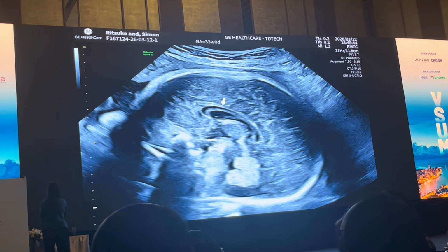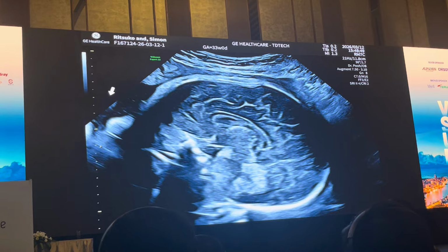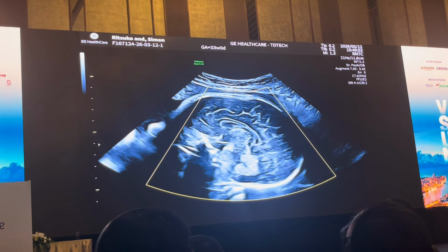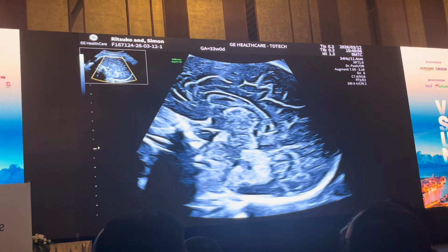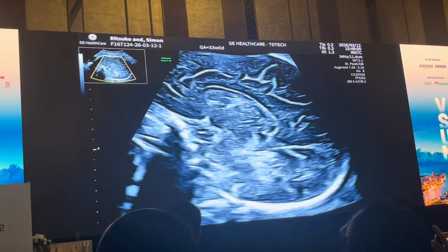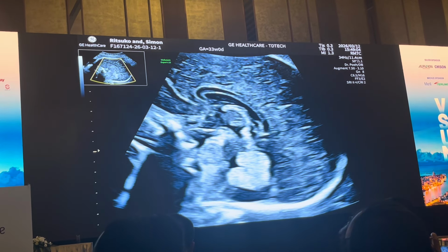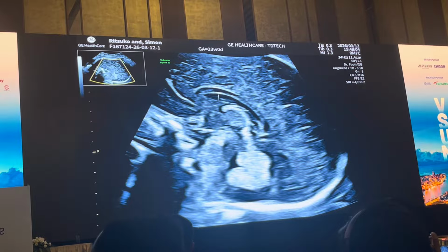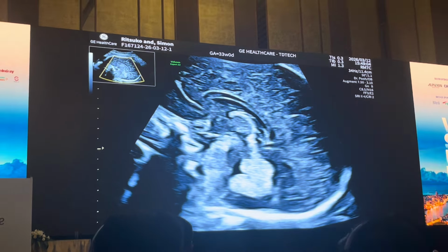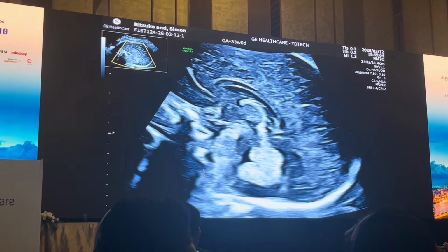Once I rotate on it, it very predictably brings into view the corpus callosum. What's important for me when I get this image is that I keep my vermis in view. Once I magnify the image of the vermis, I go to my gradient, which I put on max, and my dynamic range, which I increase. Then with very gentle motions, I can see the rostrum, genu, body, splenium, the tela choroidea. If I come down, I see the tegmentum, I can see the fastigial point, and I can see the vermis.